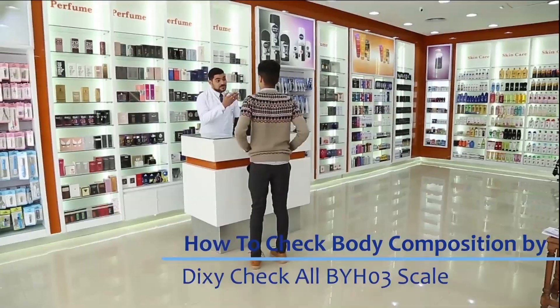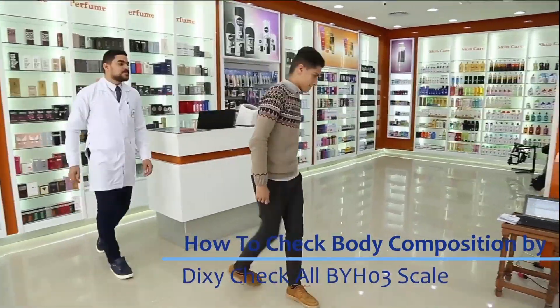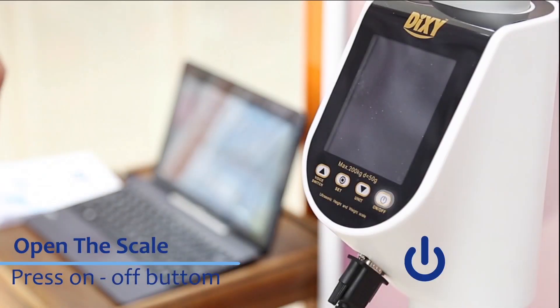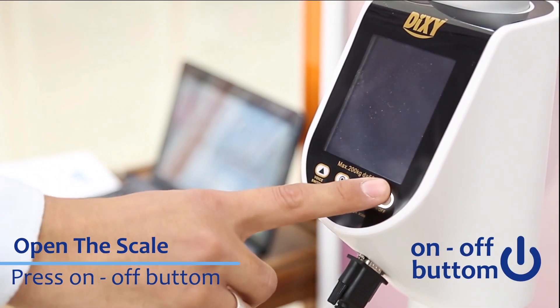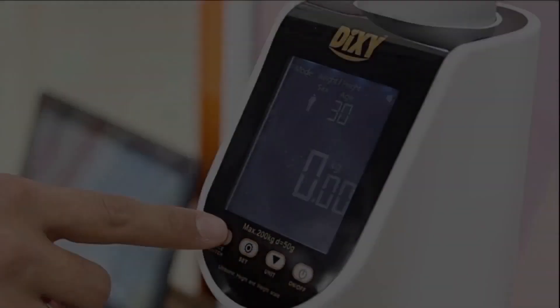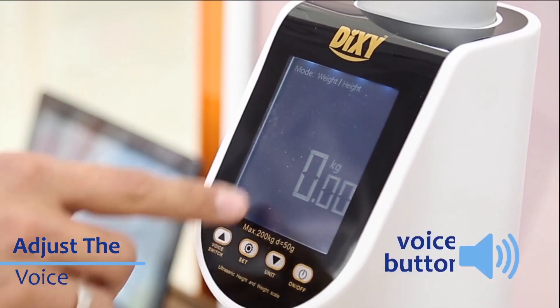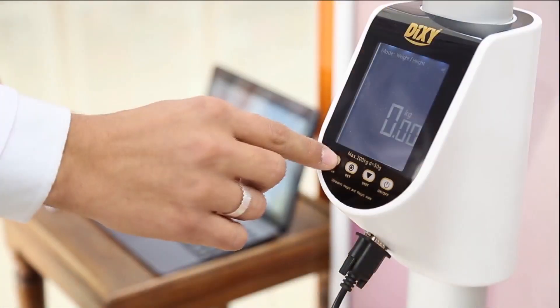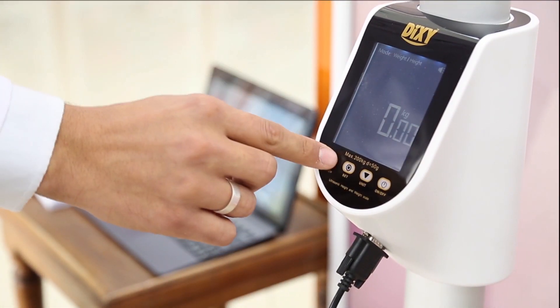How to check body composition by Dixie Check-All BYH-03 scale. Open the scale by Step-On technology or use the On-Off button. Then adjust the voice — the scale can operate with or without voiceover for instructions and results according to your need. Just press the Voice Switch button.